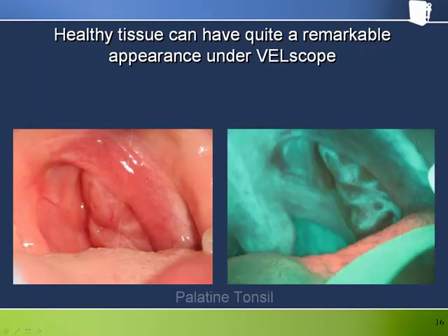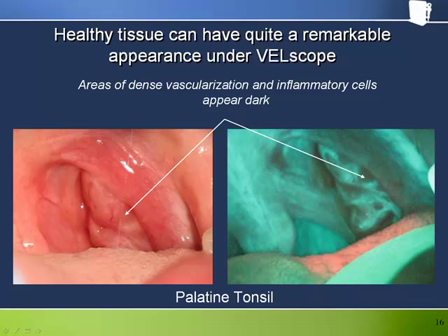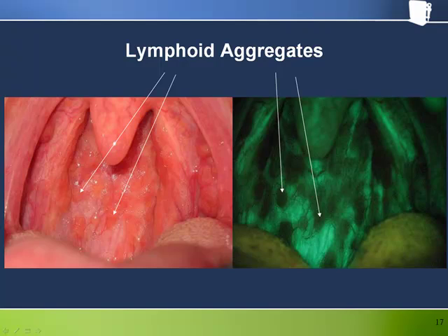Some structures in the mouth have quite a remarkable appearance under Velscope. A good example is the palatine tonsil, with areas of dense vascularization and inflammatory cells appearing quite dark. The darkened anterior tonsillar pillar is again evident in these pictures. Occasionally, collections of so-called lymphoid aggregates can populate the rear oropharyngeal wall and, because of their blood content, have a strikingly dark appearance when viewed under fluorescence visualization.